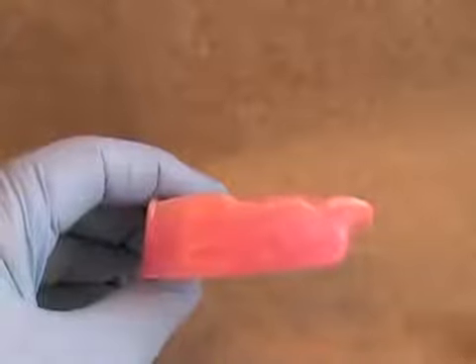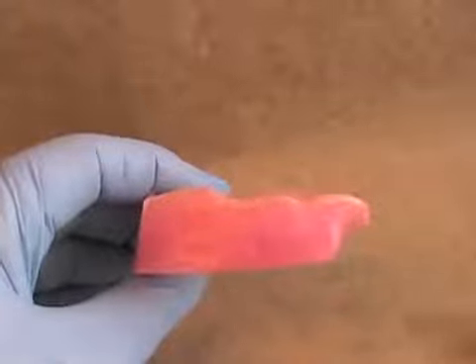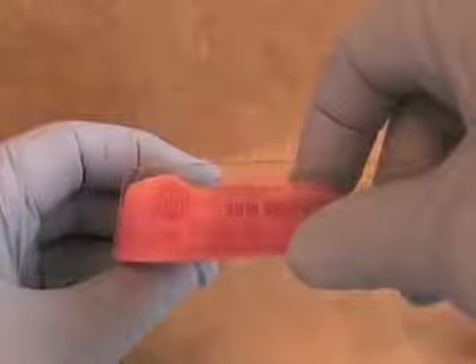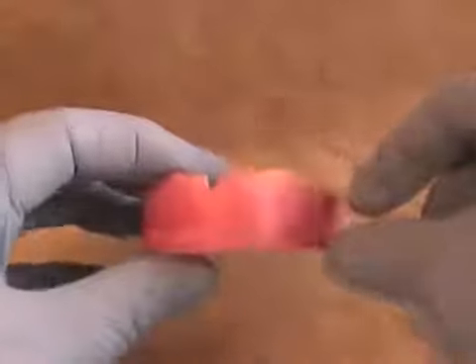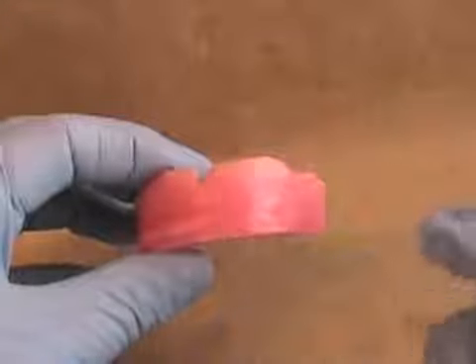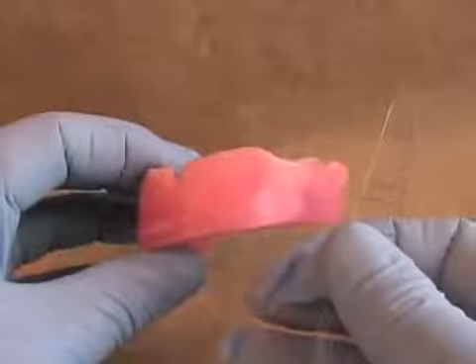Before beginning with your wax rims intraorally, you should check to make sure some basic criteria are met. First of all, in the maxillary arch, there should be an angle to your rim so that there's a little bit of proclination. You can use the Fox bite ruler to check that angulation. It's usually around 80 degrees. The height of the rim in the anterior region in the maxillary arch should start out at about 22 millimeters in height. There are some marks on the ruler that will show whether that's approximately correct. That's just a guideline for starting.